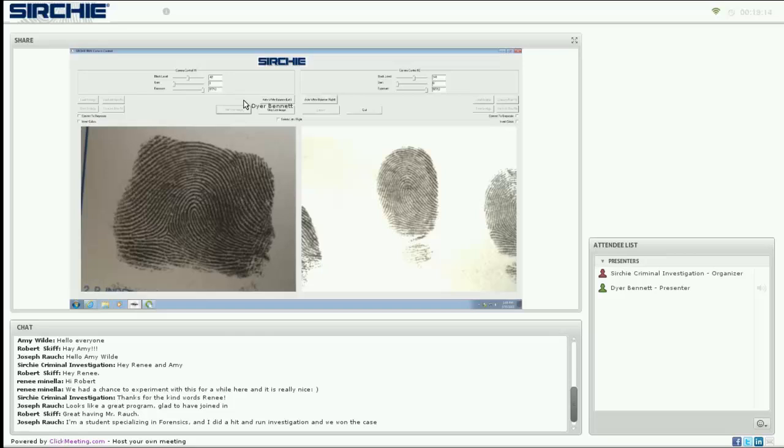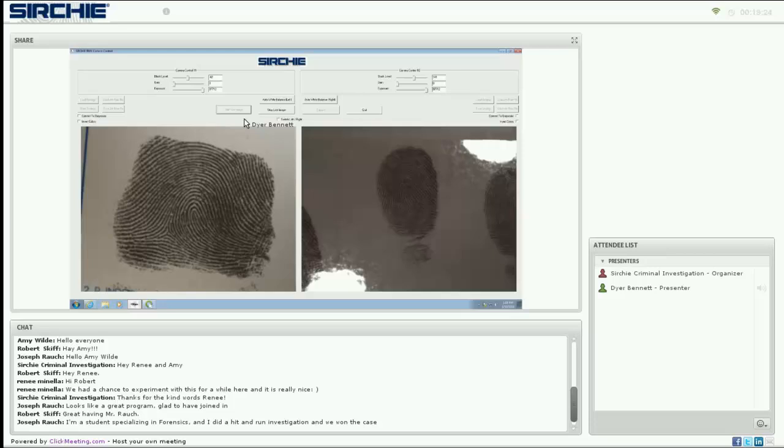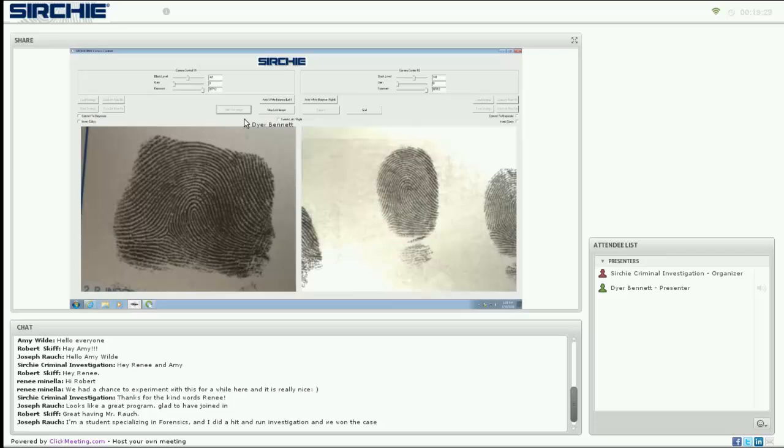Now that we have a live image, we can adjust things like the aperture and the light source. When we want to save, we stop the live image, which gives us a static image for each window. You can save these as raw files, just like you had taken them from a camera, and then transport this information over to Photoshop or any other photo manipulation software. We can also do a capture to work within the CSI PIX software.